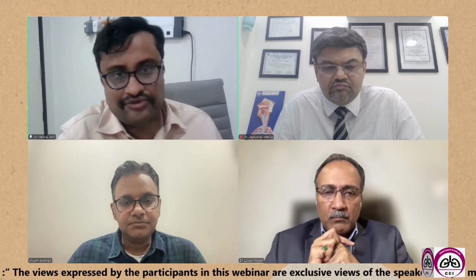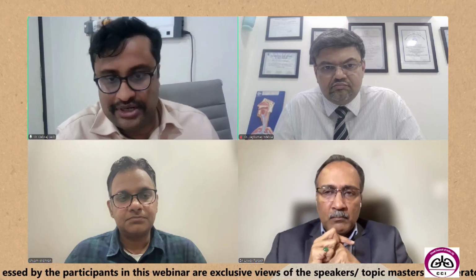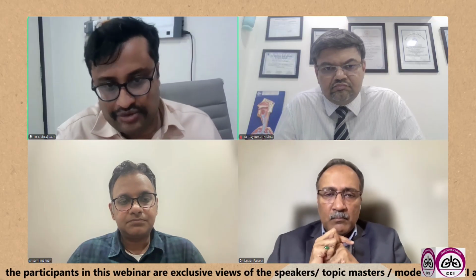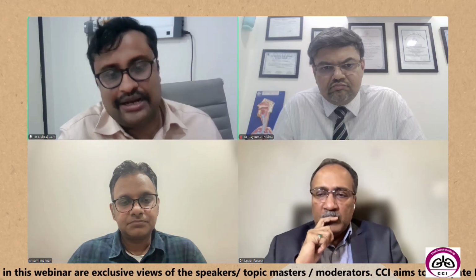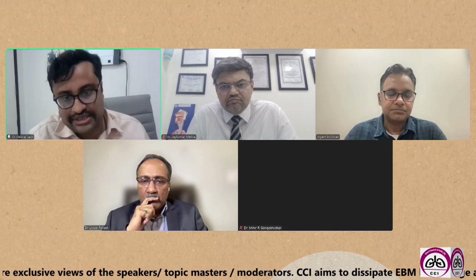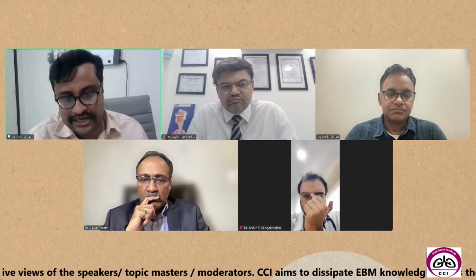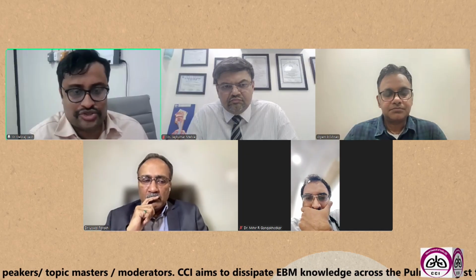So we should be very careful. We should look after the cost, but not at the expense of, as you pointed out, not only the yield, but also the difficulty of removing the needle, which will create at least chaos in the procedure room. 20-30 more minutes will be taken to remove that. So we should be careful not only of the scope but also of the patient.